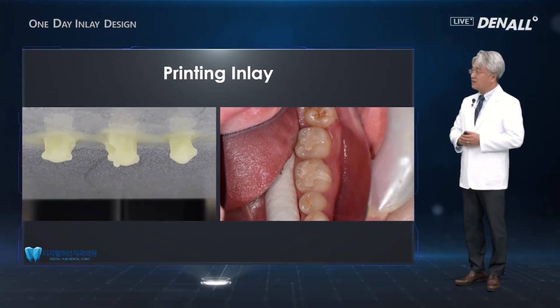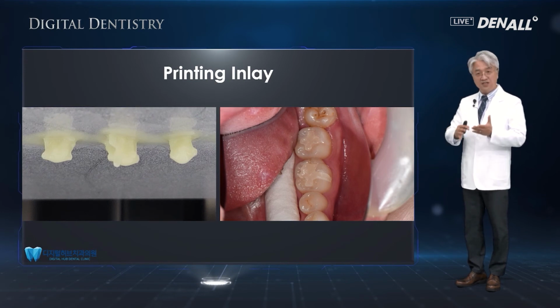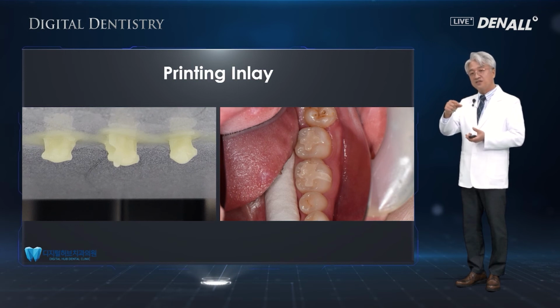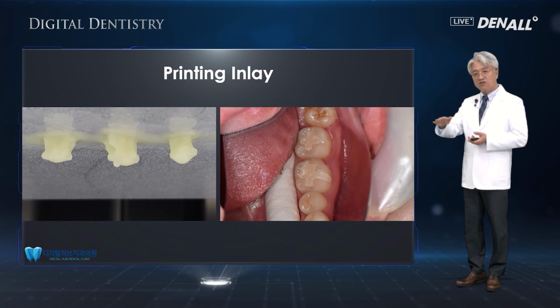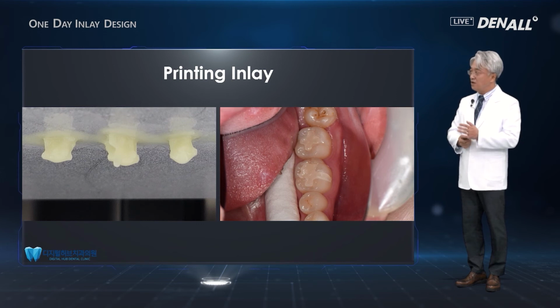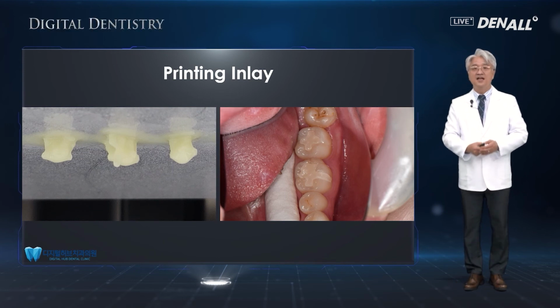Now the fit and others are being improved, and rather than adapting with the support to the patient, the support and other things are all removed before being delivered. So I think with such advancement, it can have much more satisfactory results.